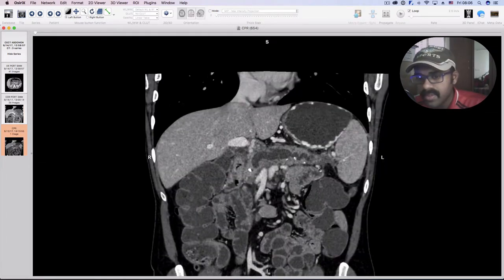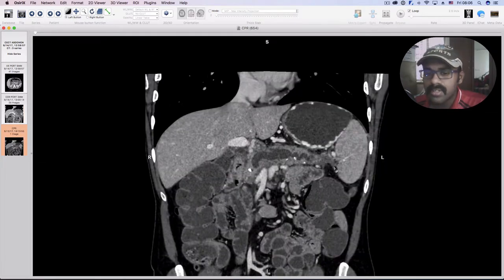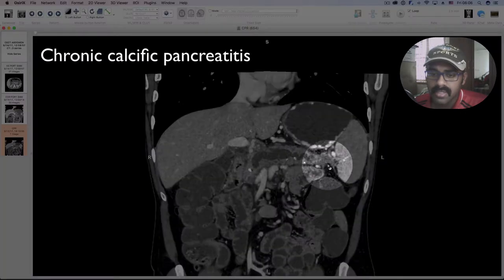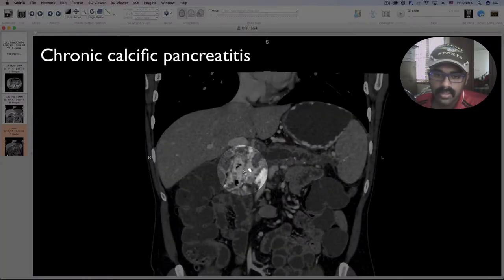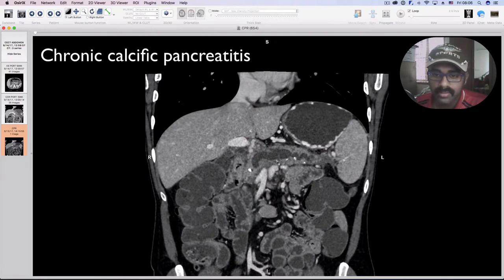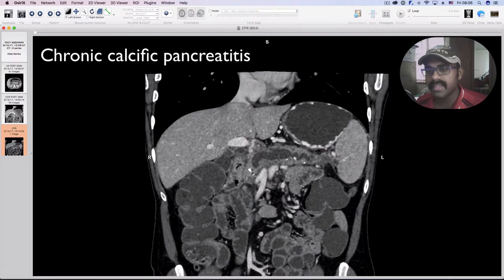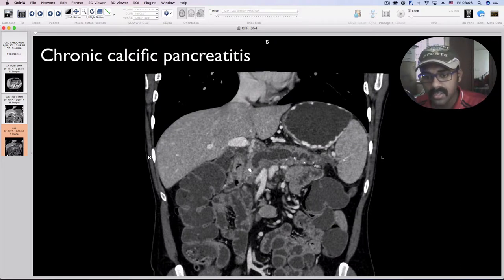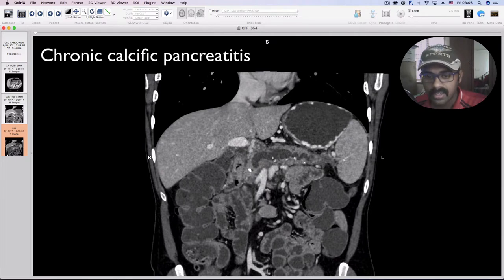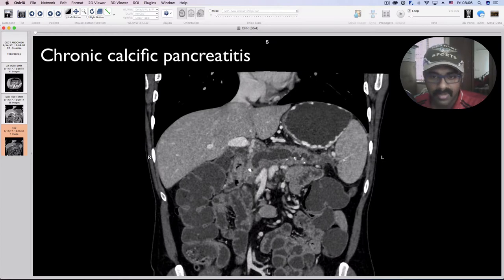This is a curved planar reconstruction. In curved planar reconstructed images, you can create an axis along which you can reconstruct the whole image so that you can demonstrate a curved structure in a linear pattern, thereby making it easier to demonstrate pathology to referring clinicians. Here, I had done a curved planar reconstruction along the direction of the dilated convoluted main pancreatic duct, clearly showing the contour of the pancreatic parenchyma.